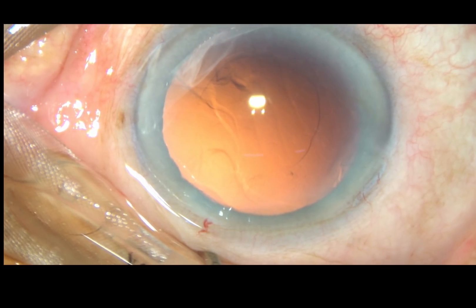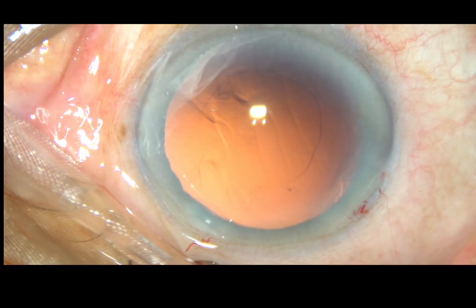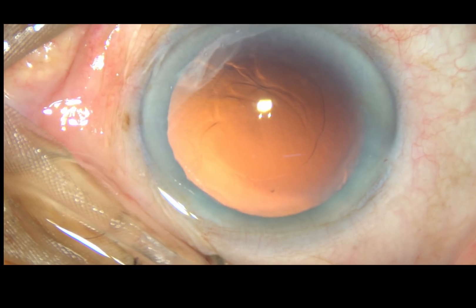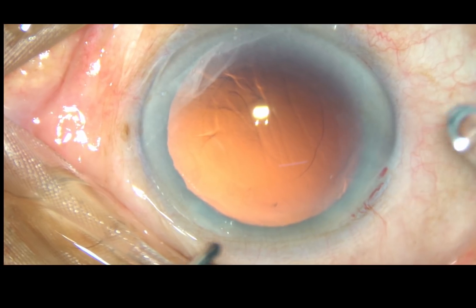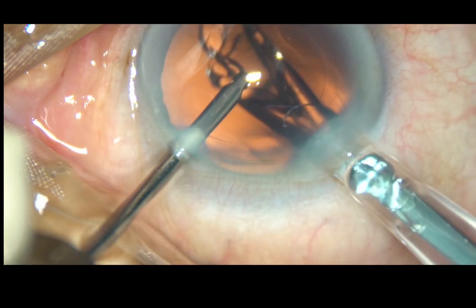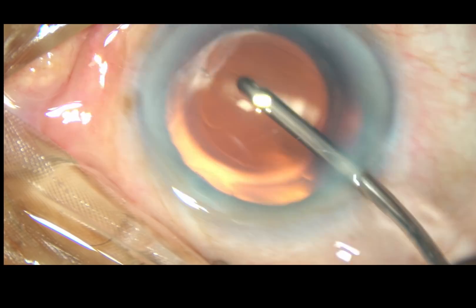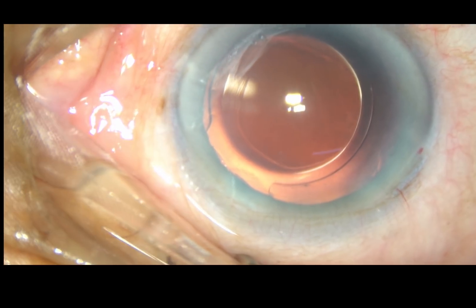In this case, we have selected a hydrophilic acrylic intraocular lens. The lens is being implanted under irrigation. This is the irrigating probe being used for polishing the posterior capsule — we can call this hydro polish. The anterior chamber is kept formed by irrigating fluid. Here goes the intraocular lens: the leading haptic goes into the bag, and the trailing haptic is pushed into the bag by the irrigating probe.